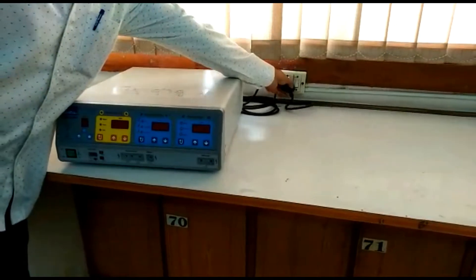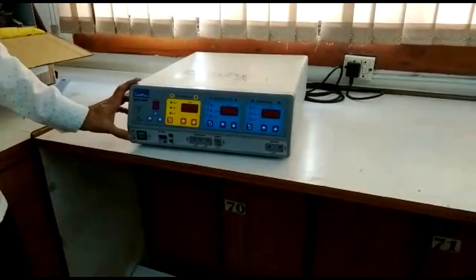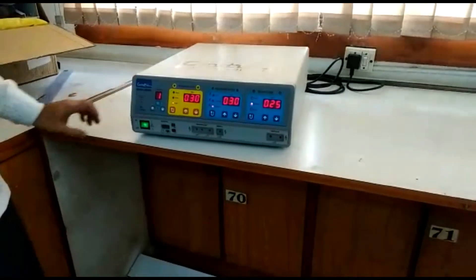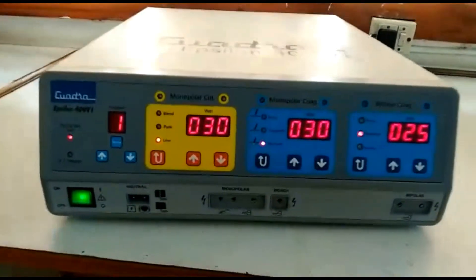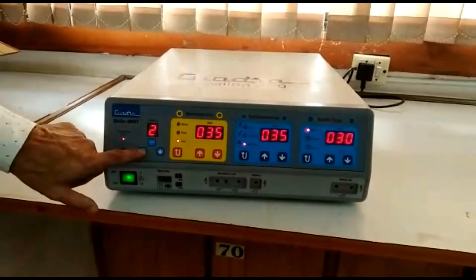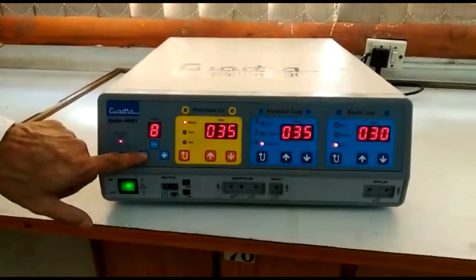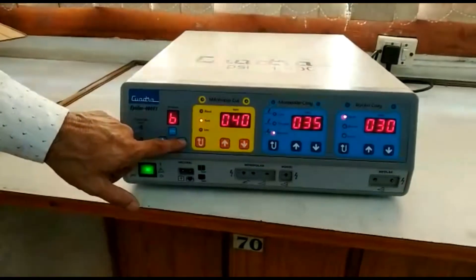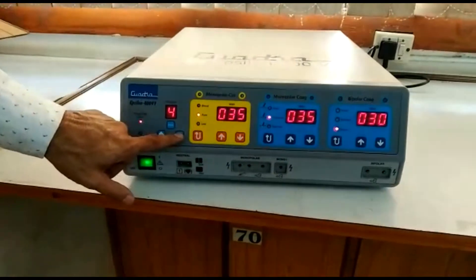The other end goes into your power socket, and then you switch on the machine using the power button on the front panel. For all three windows, the selected mode is indicated by the glowing LED. You can increase or decrease the program number using these buttons. Programs 0 to 9 cover monopolar and bipolar settings. Program B is bipolar cut and E is for Endocut — these are two special modes that come with Epsilon 400.